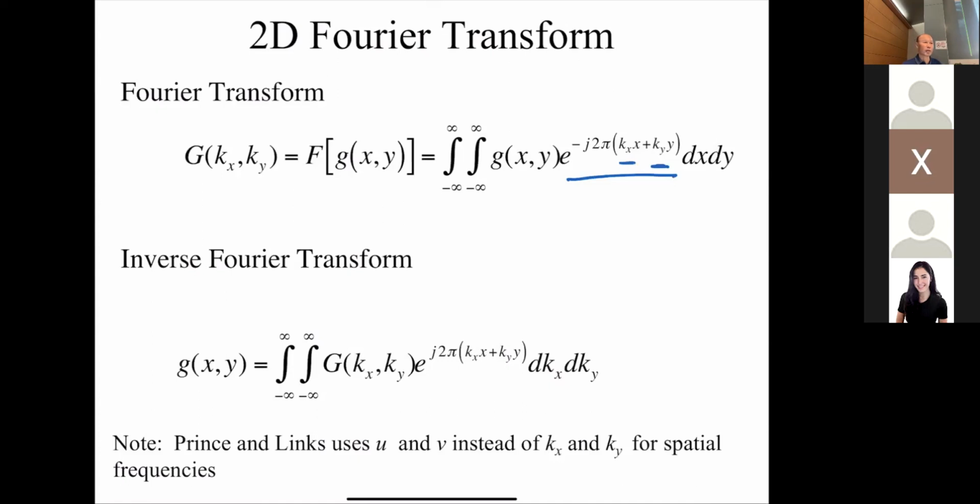So today, for this class, we're just going to talk about 2 dimensions, but just know that MR is very rich in the sense that you can actually have n-dimensional data, okay? So the basic idea is this is what the MR signal is going to look like. Okay, and that's what we're going to work up today. And so then we take that MR signal, we gather the data in K-space, and then we put it into MATLAB or Python, and then we do an inverse Fourier transform, and we get back our image. Okay, to first order. As we'll see, this can be more complicated than that, but this is the basic concept we want to go over today.